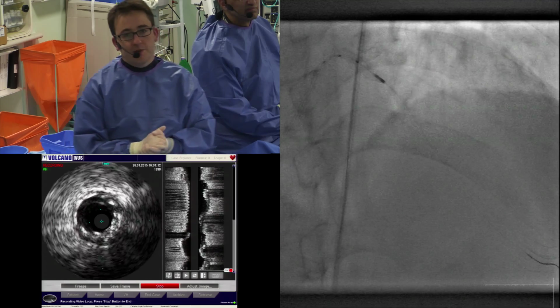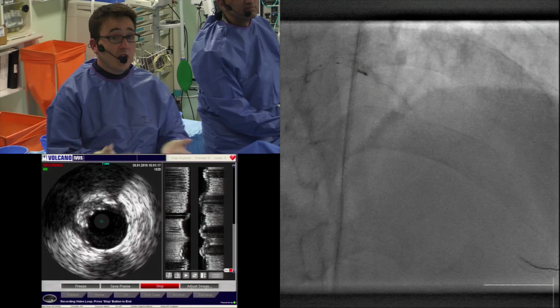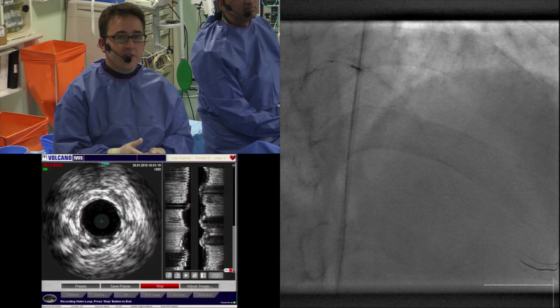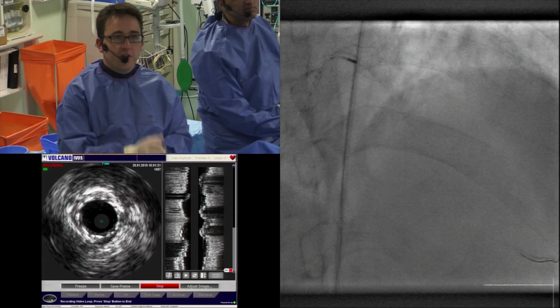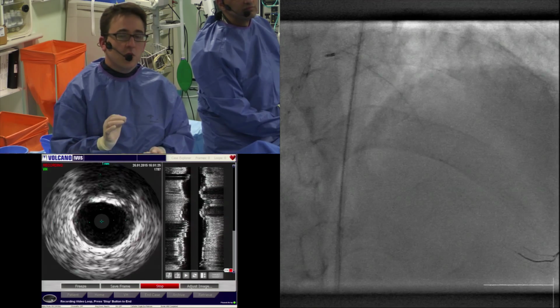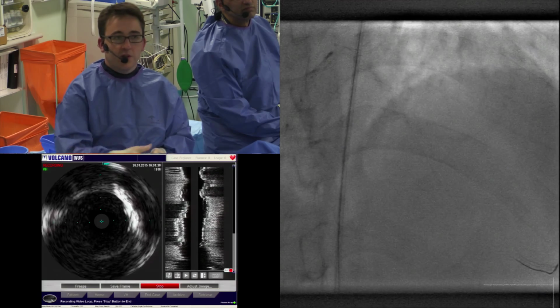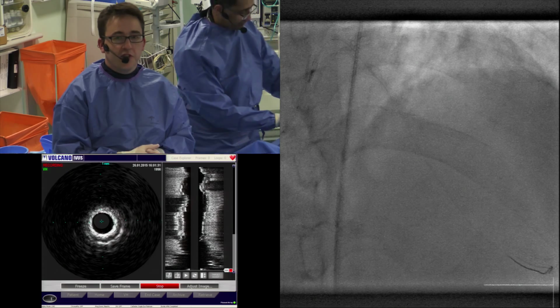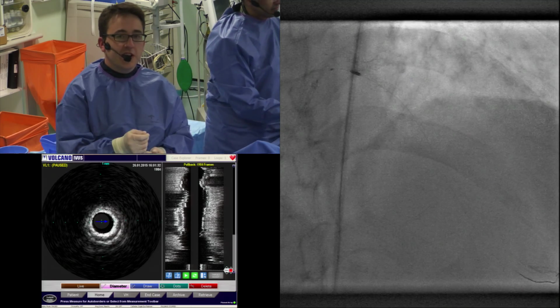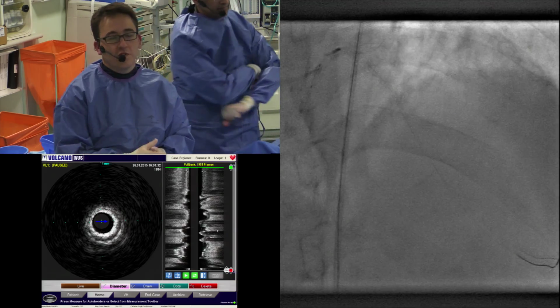The other question I've been asked is about ECGs, and particularly with regards to IFR. Well, IFR at the moment does require an ECG, and essentially this is to make things very robust, very simple and very easy to use. However, what we're developing, and some data will be presented at the meeting coming up in April and May of this year, is a new technique which uses IFR but no longer requires the use of an ECG. So it makes things even simpler and even easier to use.